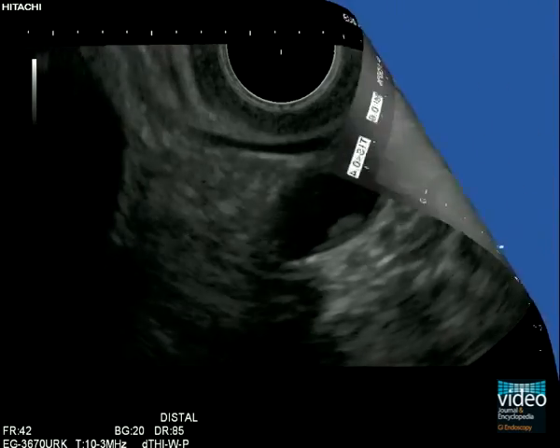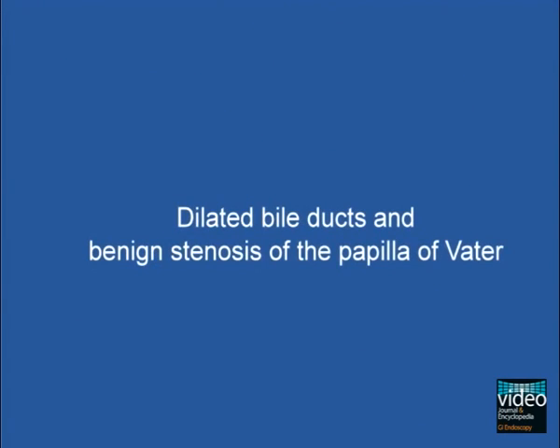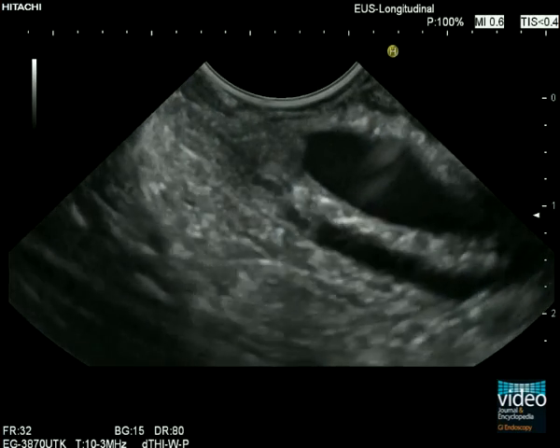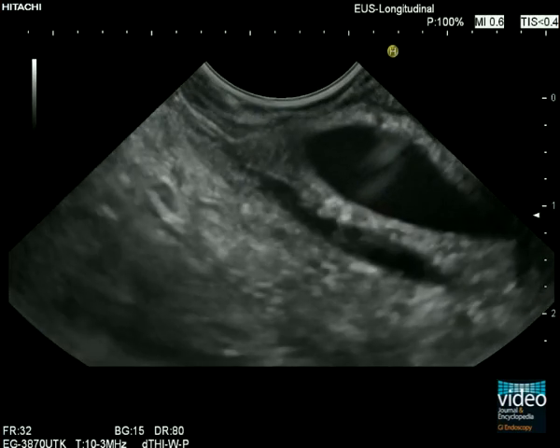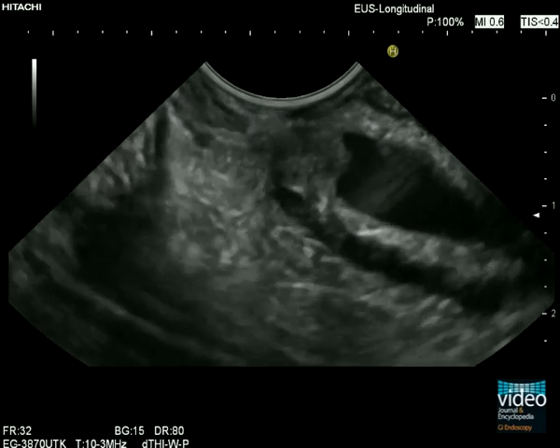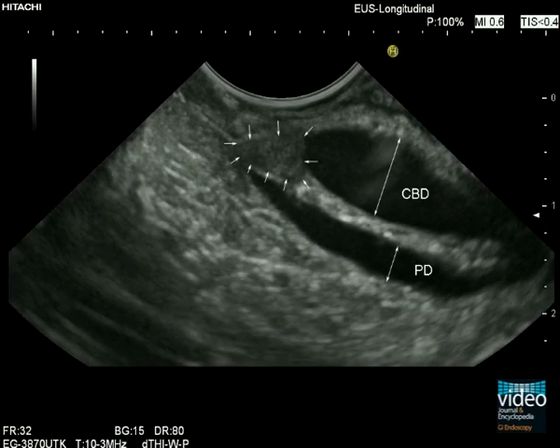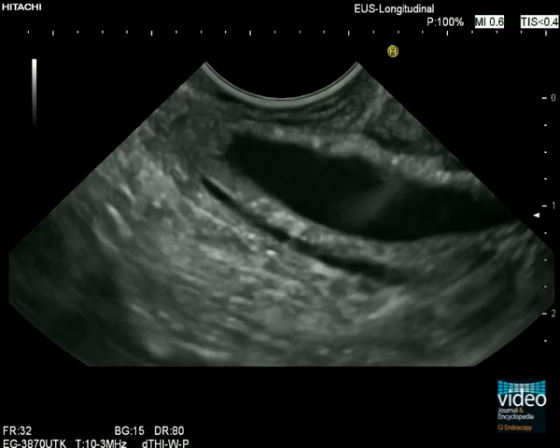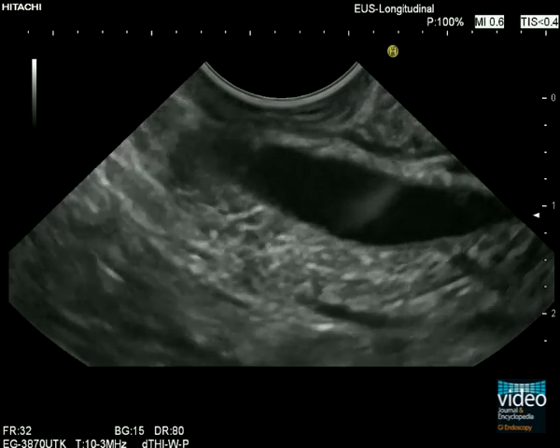Slight dilatation of the common bile duct and sometimes of the pancreatic duct is a common finding in older patients, in particular several years after cholecystectomy. The papilla is finally delineated without any suspicion of tumor or bile duct stone. The most common cause of benign stenosis of the papilla is adenomyomatous hyperplasia, which can be proven by performing biopsy after endoscopic sphincterotomy.